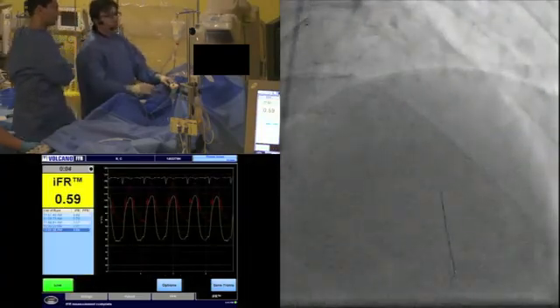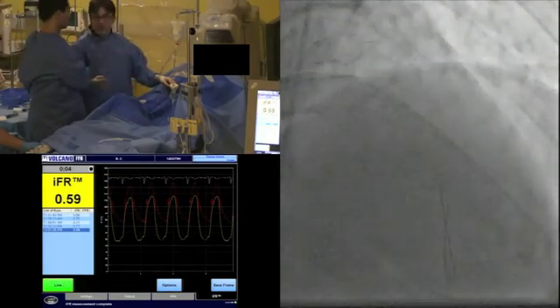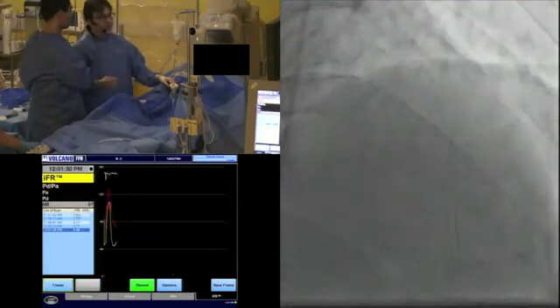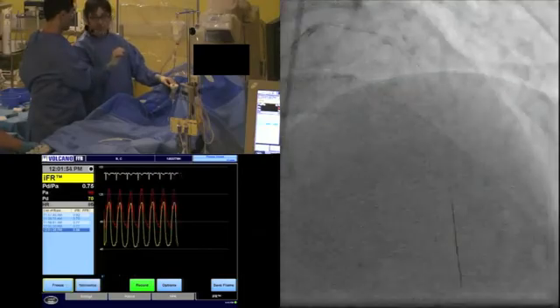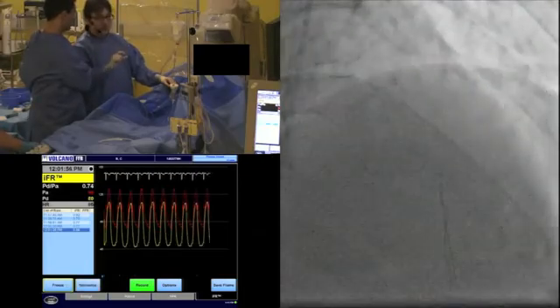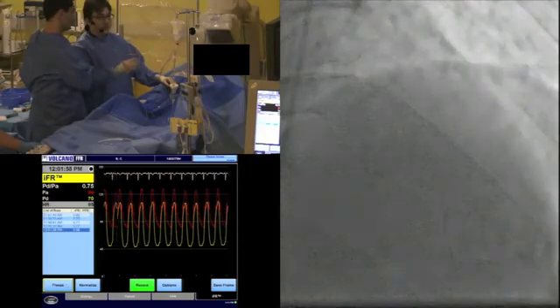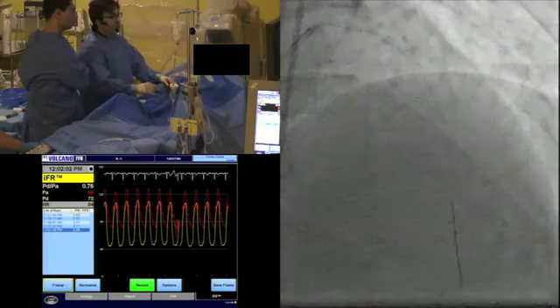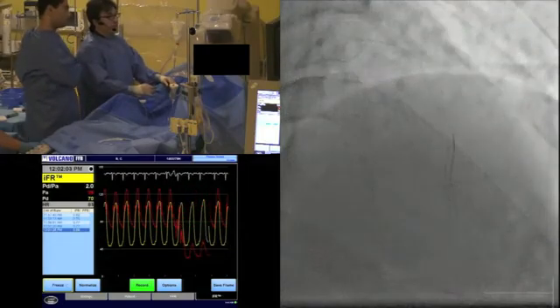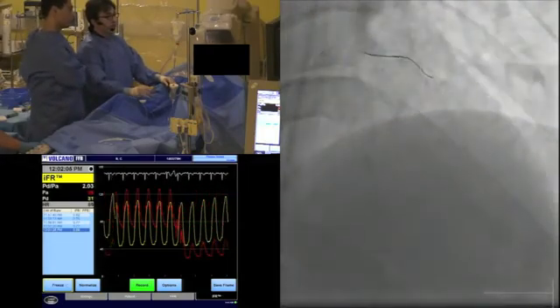So we've got a very interesting result here. We've got very significant circumflex artery disease and very significant LAD artery disease. A lot of the pressure drop seems to be occurring in that distal left main stem, but there's further disease, of course, in both those vessels. There's disease in the marginal and in the diagonal branch as well. So I think let's come out, check normalization, take a check angiogram picture, and we're probably finished here.